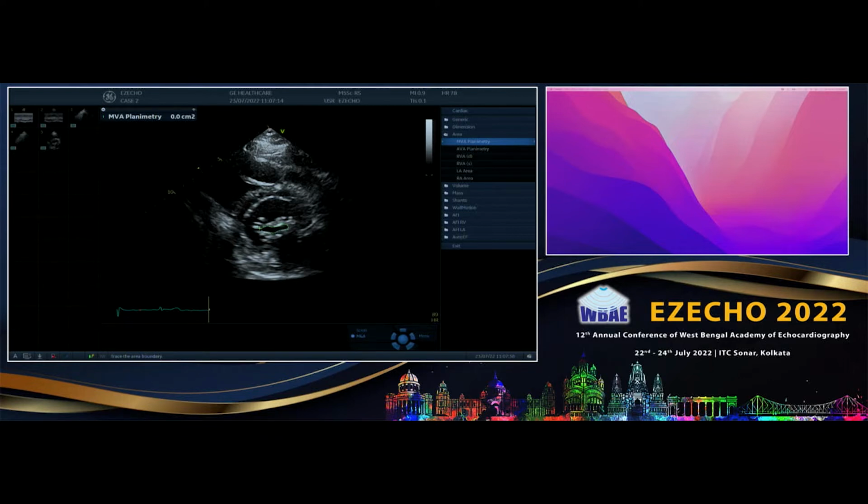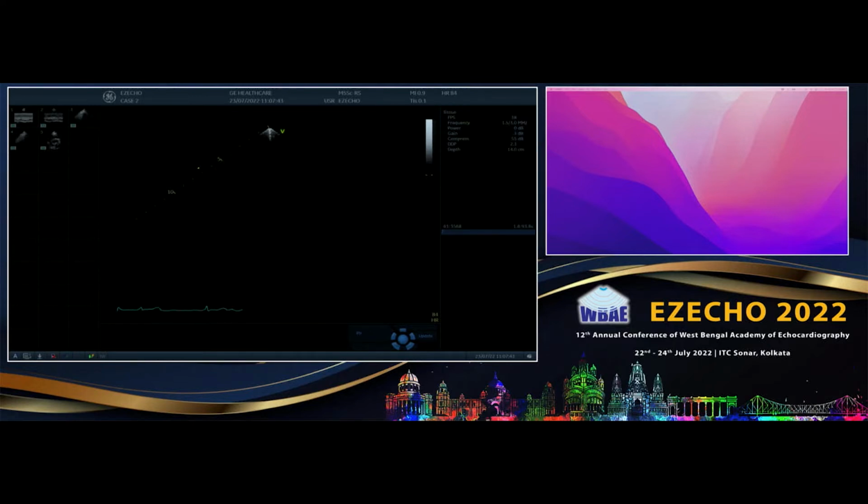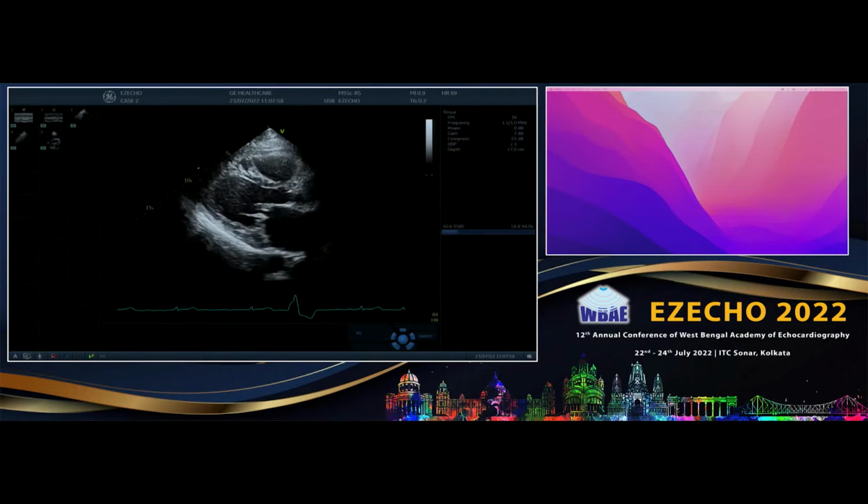And that is a very strong indicator of acute rise in LA filling pressures. And that can explain the patient's dyspnea on exertion or exercise intolerance. You may find it very outlandish, but once you start doing it, you really find it. I think that is the most important indicator of rising LA pressures, rather than doing all those E by E primes at peak exercise, which are very difficult.